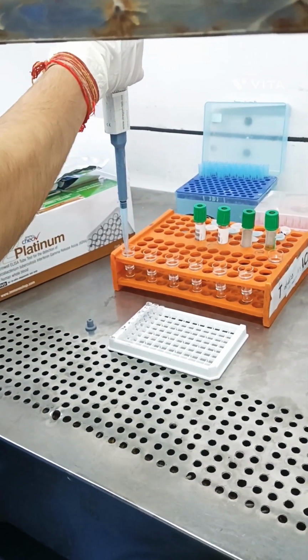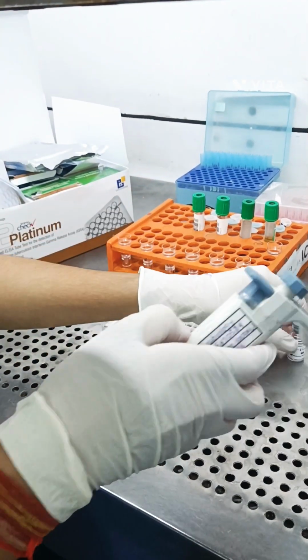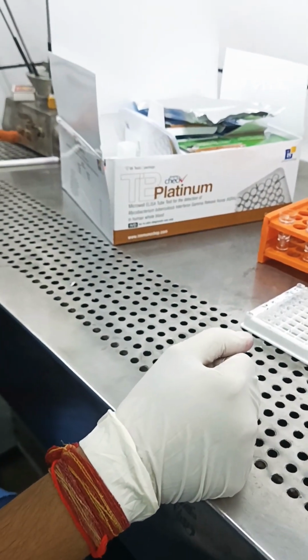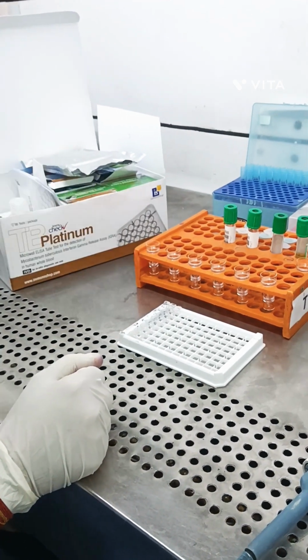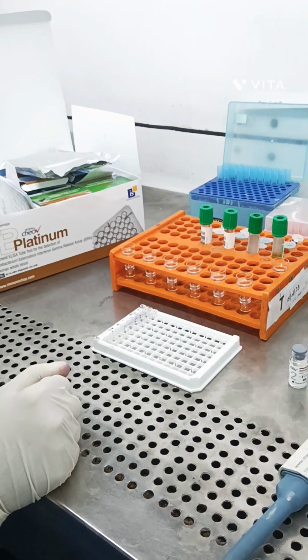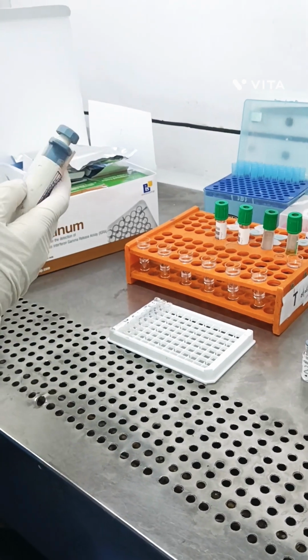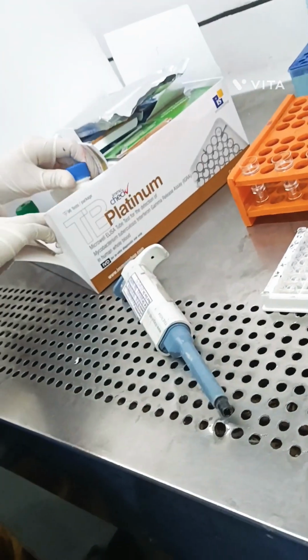Then for the second to sixth tubes, take standard dilution buffer.